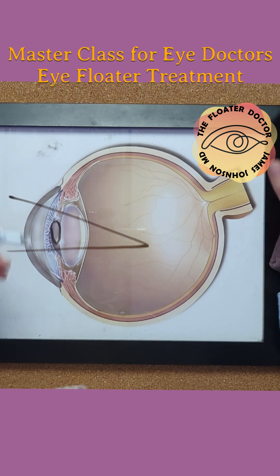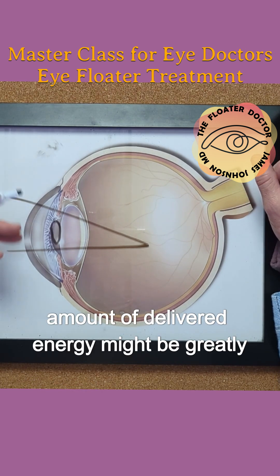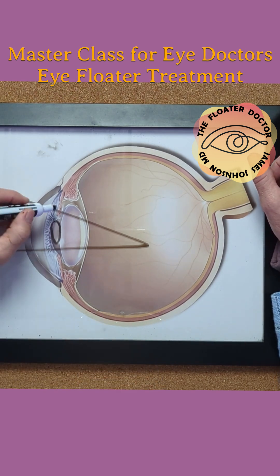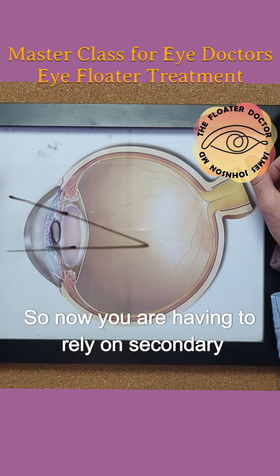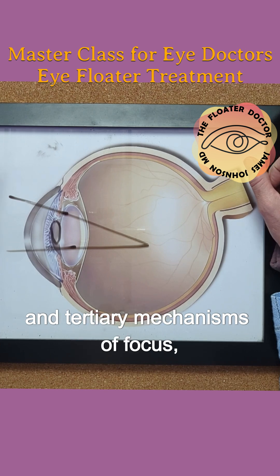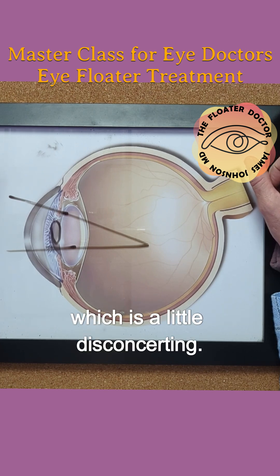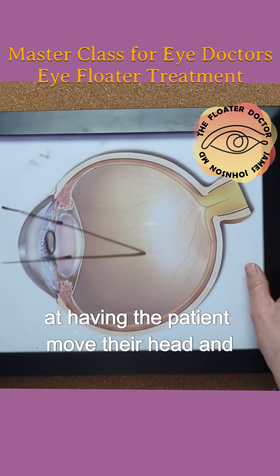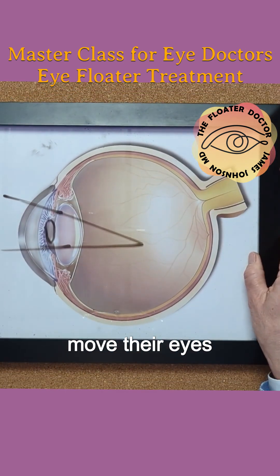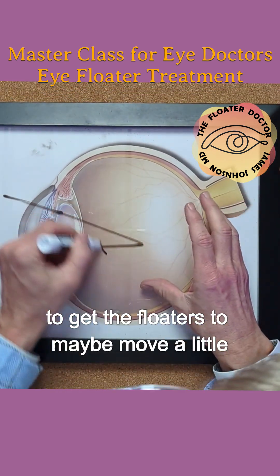You're blocking a lot of energy, so the amount of delivered energy might be greatly reduced. But also, that might block the focusing beams. So now you are having to rely on secondary and tertiary mechanisms of focus, which is a little disconcerting. Or you might just have to work harder at having the patient move their head and move their eyes to get the floaters to maybe move a little bit more anterior.